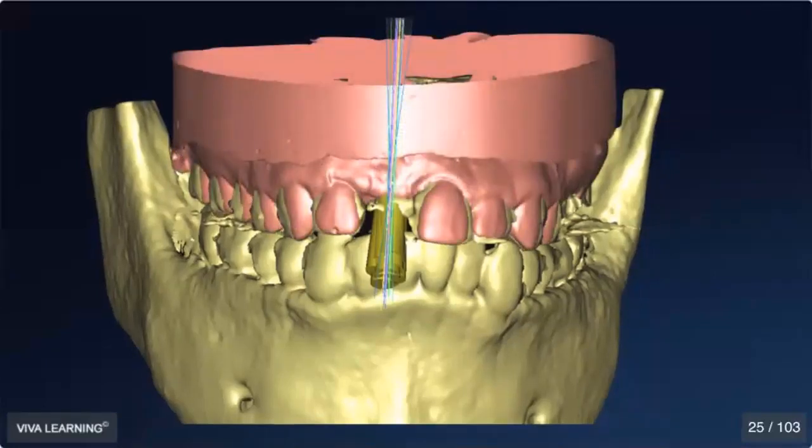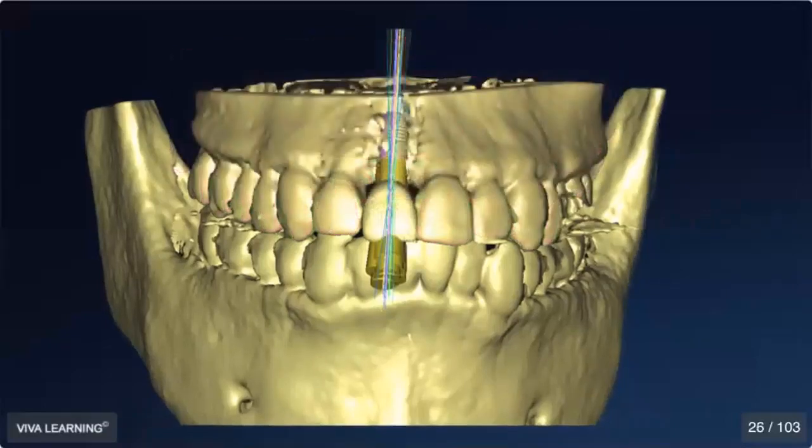We've also combined the CT only with the scenario where we have an intraoral scan overlaid as well. And what if we have what we call a dummy tooth, where the software allows us to place and position an implant roughly in space based on a virtual tooth that you can slide around into position.